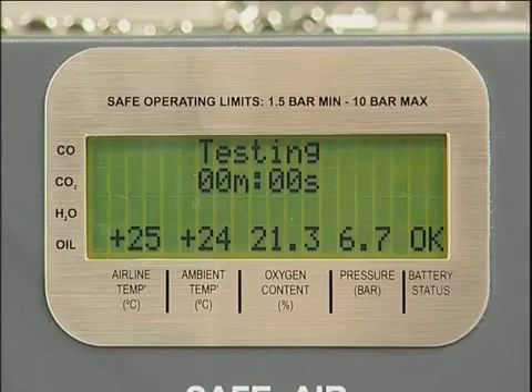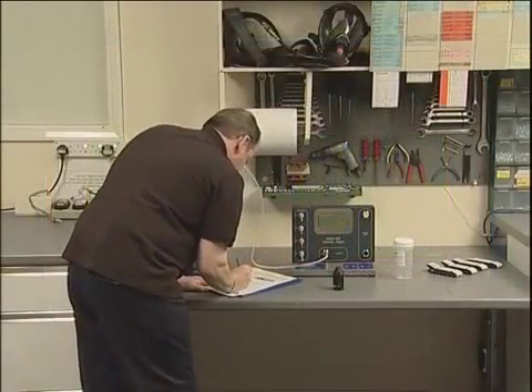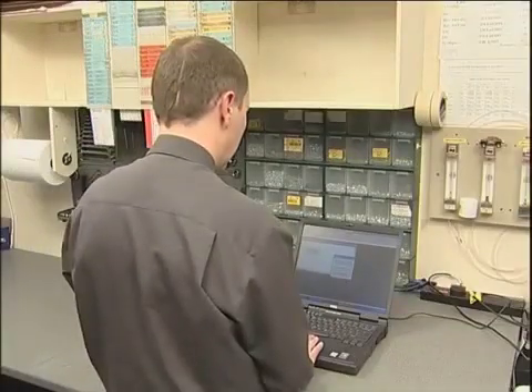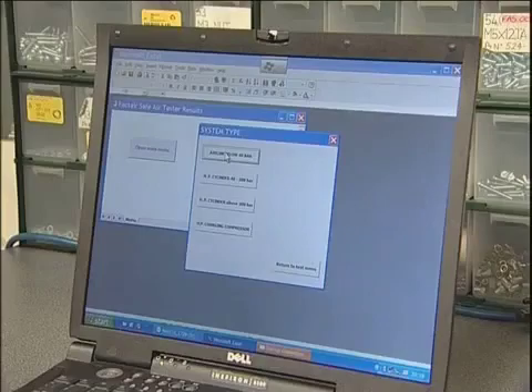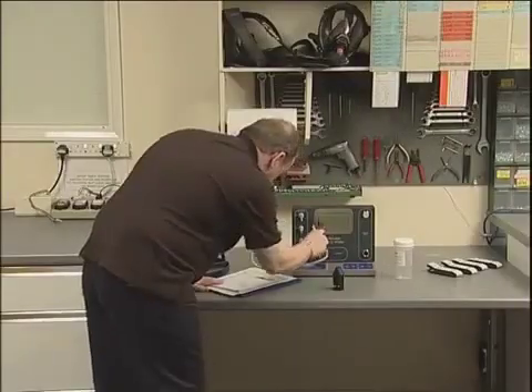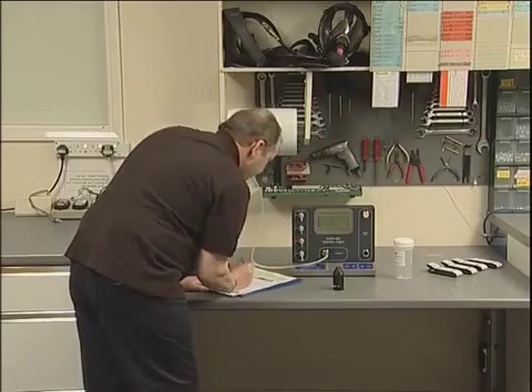The readings on the display will now be locked and should be recorded on the results pad or directly into the Excel tester results spreadsheet. A copy of this spreadsheet can be downloaded free of charge from Factair's website. Tube readings can be taken either at the end of the test or individually when the status bar indicates that flow has ceased through a particular port.